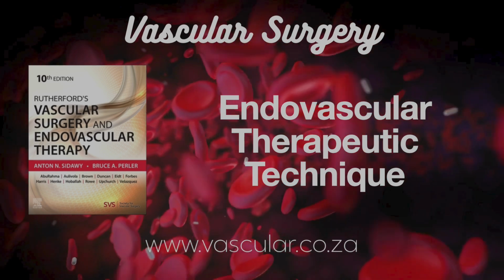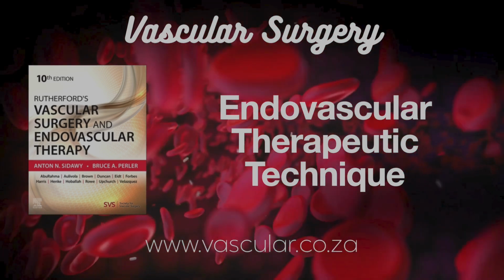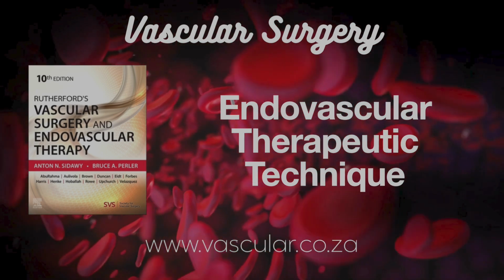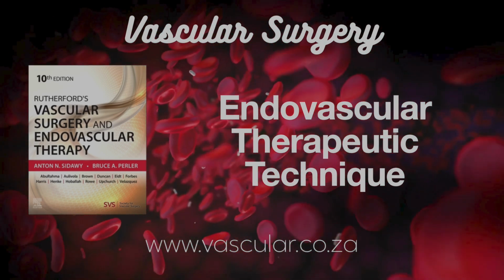Things to watch out for. Where the CFA splits can vary. Heavy calcification makes puncture risky. Might need to use the other leg's CFA, or even arm arteries like brachial, radial, or the SFA itself sometimes.